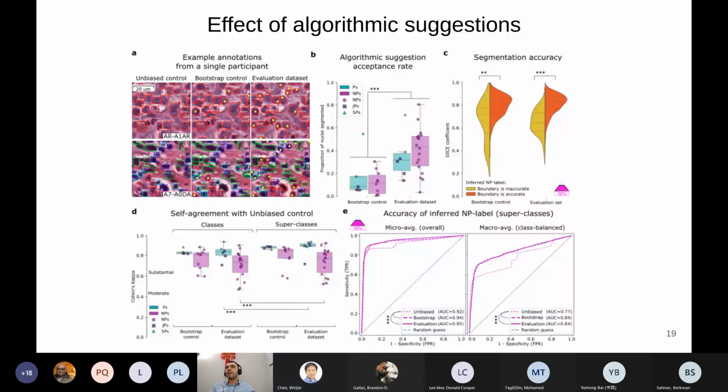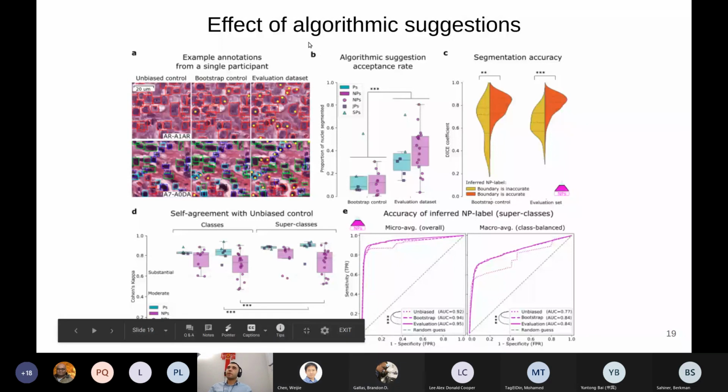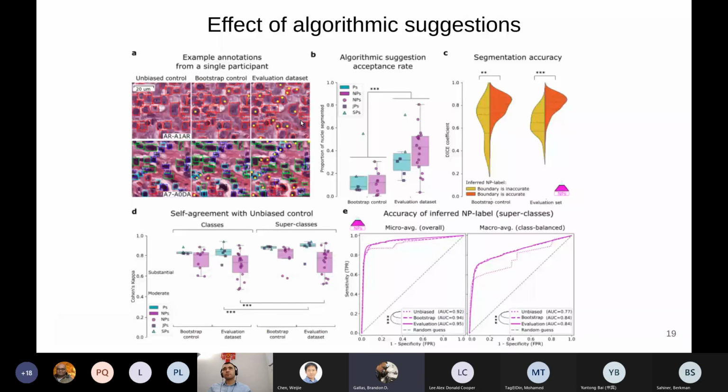Except here we have a hybrid data set, so it's not really segmentation. It's a mixture of bounding boxes and segmentation. Yes, you're right. So the evaluation is the semi-automatic. And it's not totally manual because you're already putting red bounding boxes around things. You mean for the unbiased or for the evaluation? The unbiased.